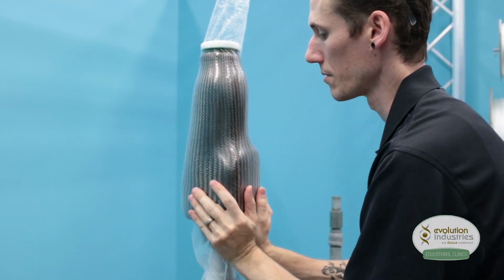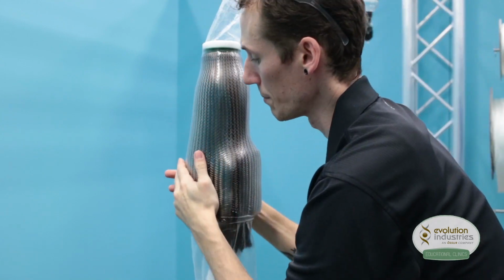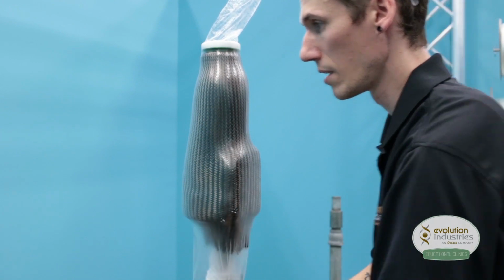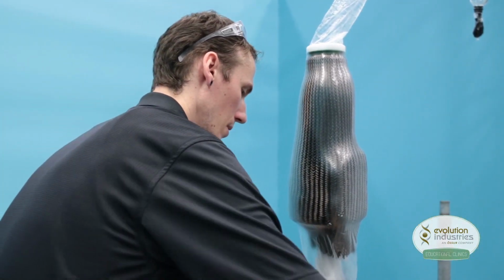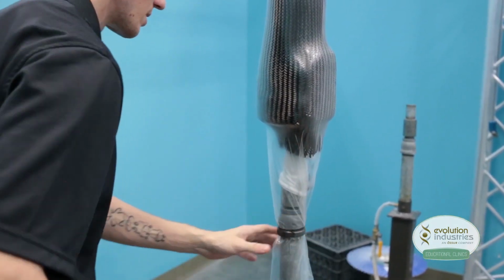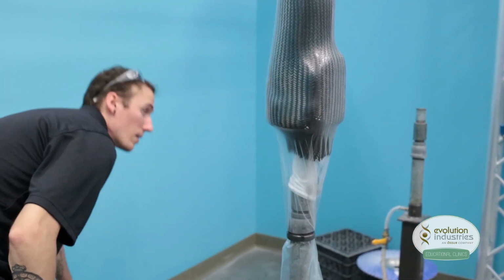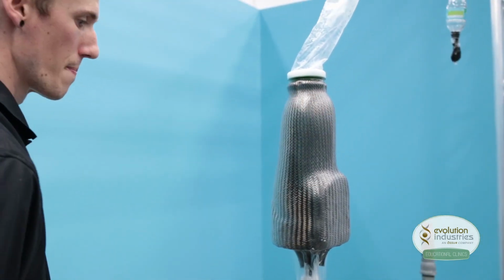And you want to pull it down until it's nice and snug around that lamination dummy. Once it's nice and tight around there, you tape it around at the bottom. You don't have to worry about tying off the top because it creates a nice natural seal. And you can see it clearly pull in.